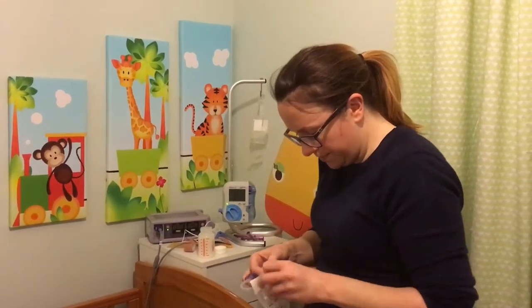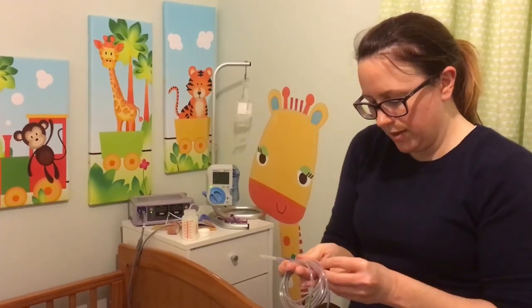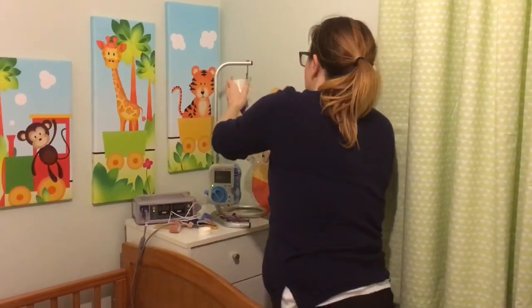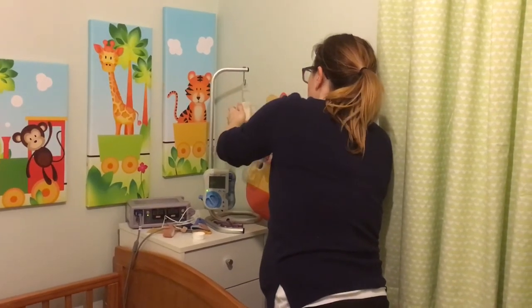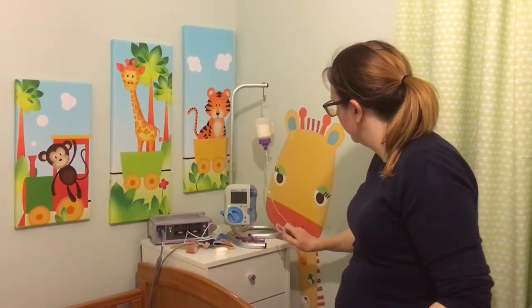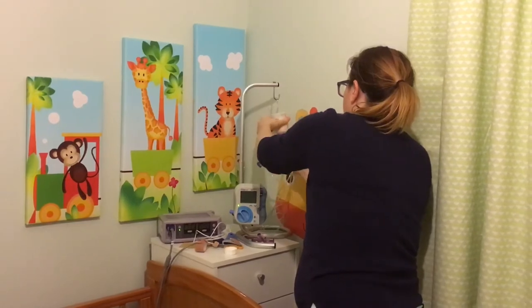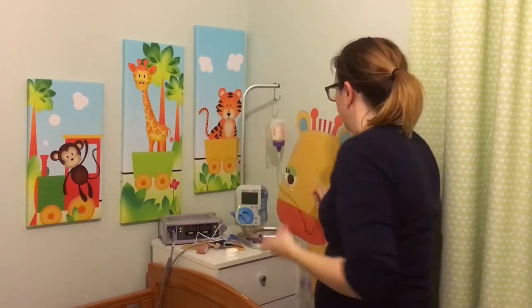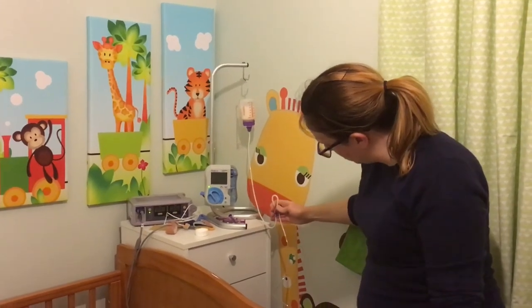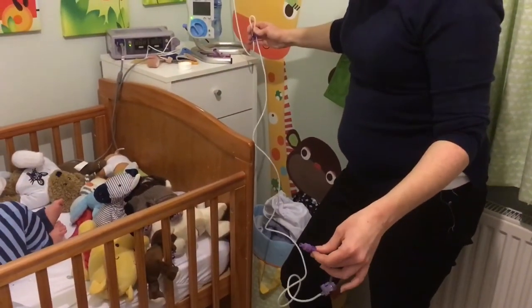So I just have to set up the feed pump. He needs a little adaptor so it fits in properly. We'll put them on the floor because we don't like leaving them in his bed. That just attaches to the end there, and this one attaches to his bottle. And then we just have to prime — pushing the milk through the line so he doesn't get any air into his tummy when the feed pump starts. We just keep this going until it goes right to the end.